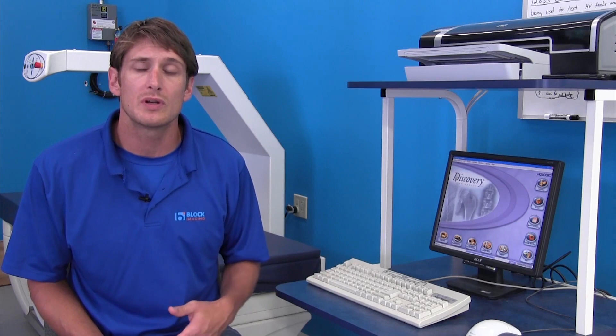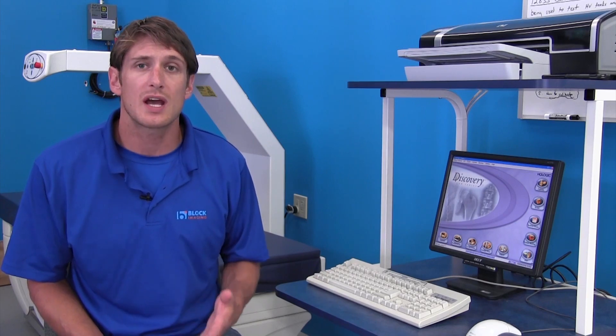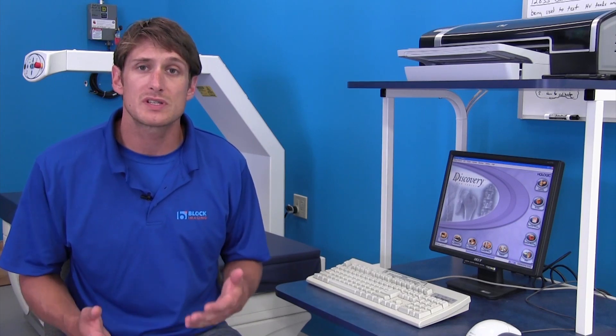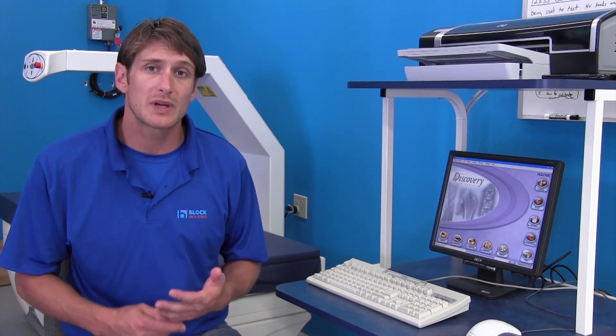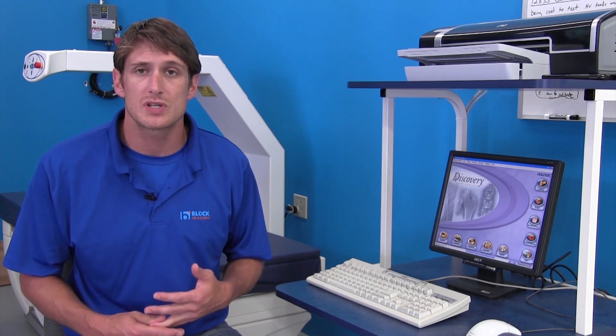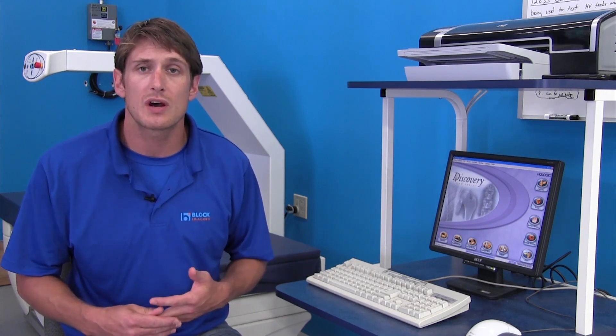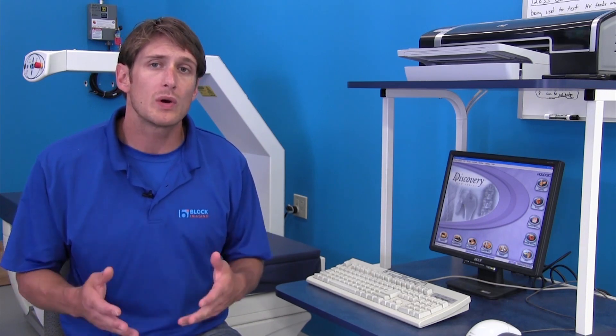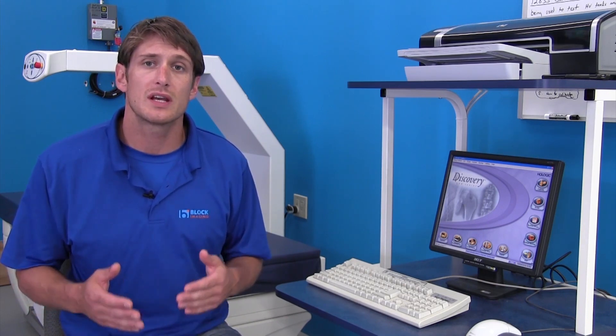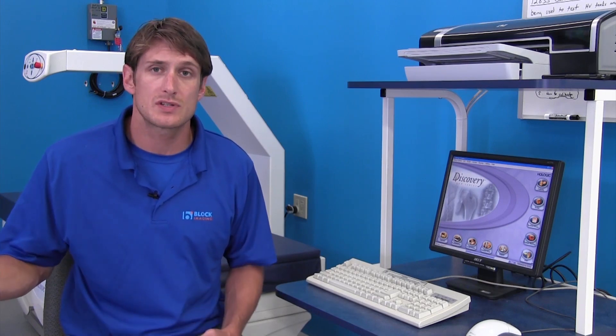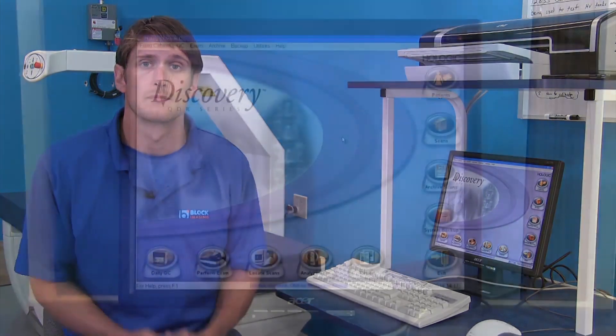This can help determine what is actually happening with your system and help us decide if it's a mechanical issue, a high voltage issue, or just software related. By knowing these errors, it can help us be better prepared to service your system.